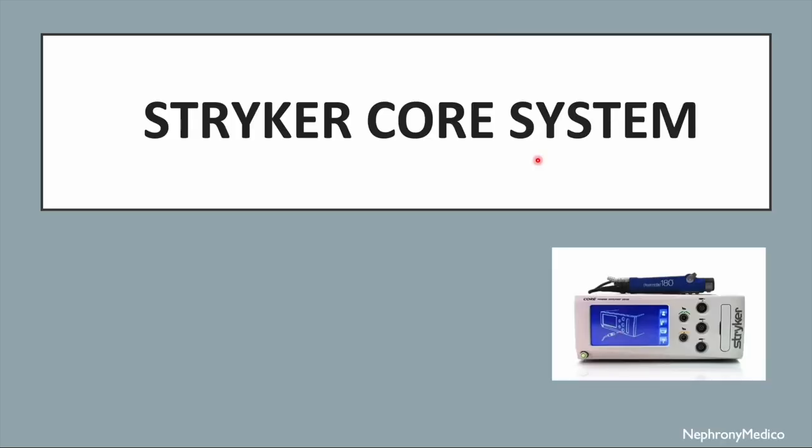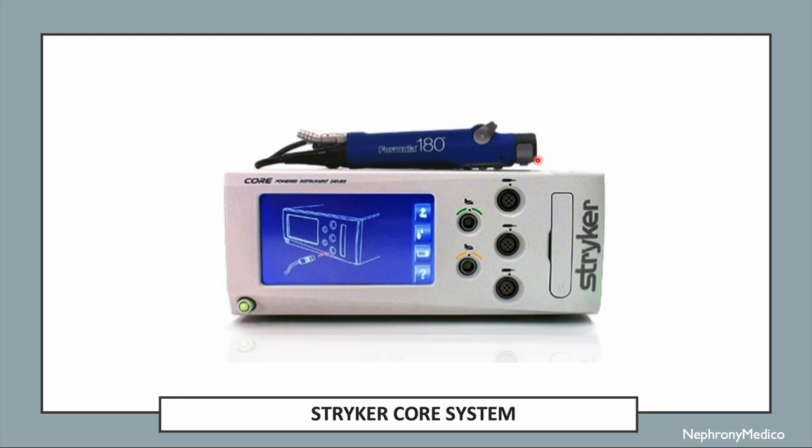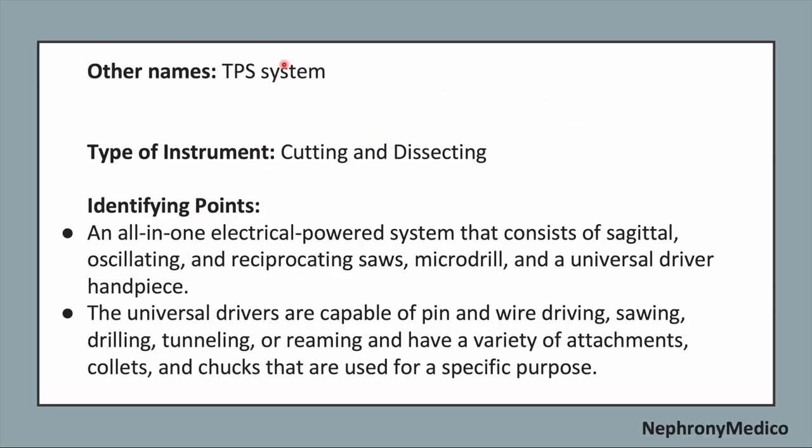Let's talk about Stryker core system. This is a picture showing Stryker core system. The other name is TPS system. It is a cutting and dissecting type of instrument.